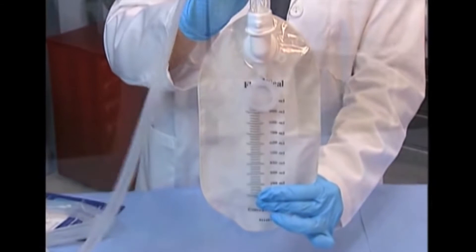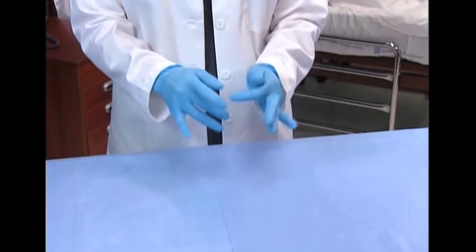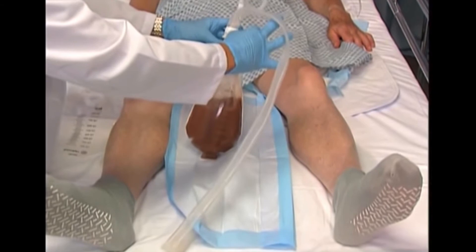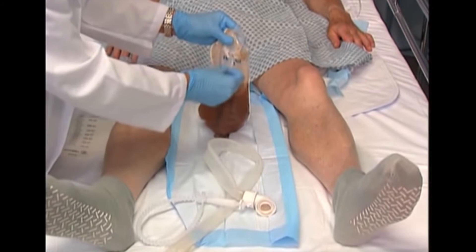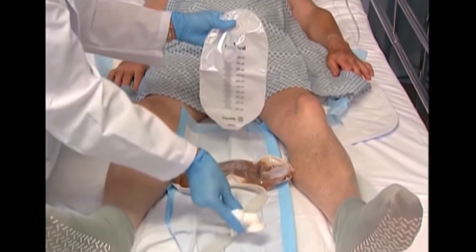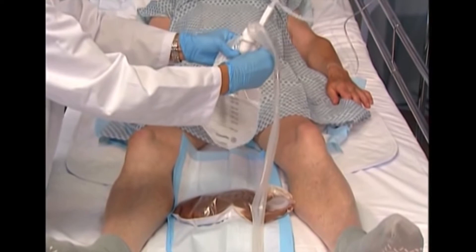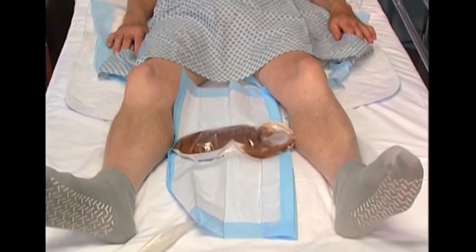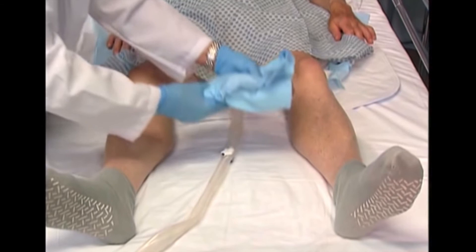Before changing the collection bag, put on non-sterile gloves. To begin the bag changing process, rest the elbow bag connector on its side on a protective incontinence pad. Make sure you have a replacement collection bag within close reach. Carefully unsnap the soiled pouch and securely snap the cap to the pouch to contain the stool. Snap the clean pouch to the elbow bag connector and position the unit to the location where gravity drainage has worked the best. There are three charcoal filter collection bags in each kit, and additional bags can be ordered separately as needed. Snap the cap onto each used bag and discard according to institutional protocol for disposal of medical waste.